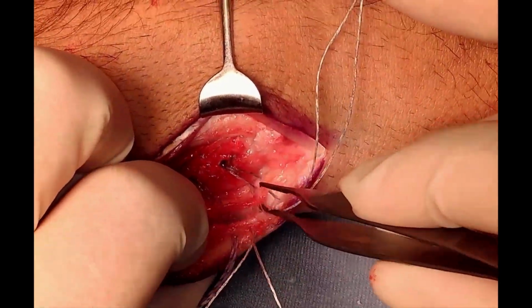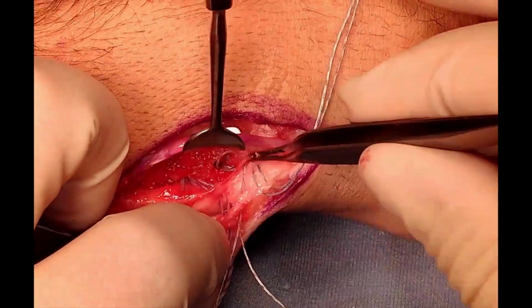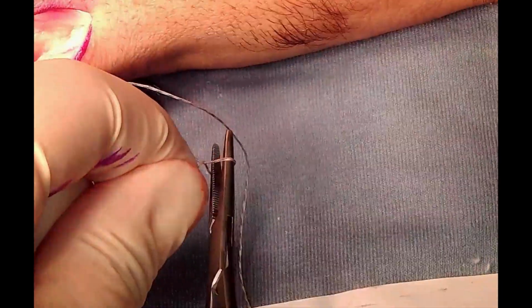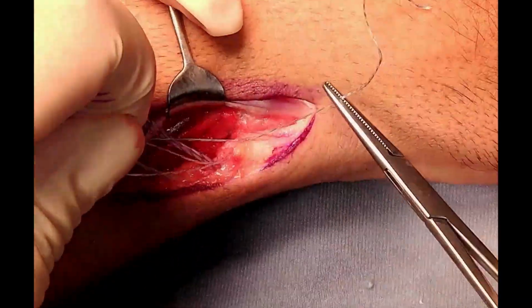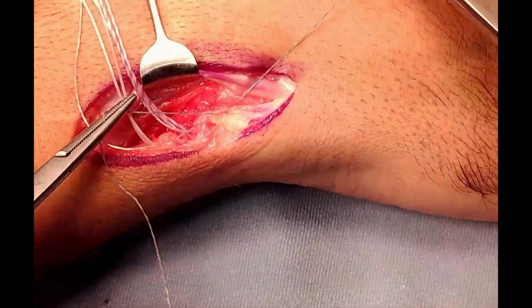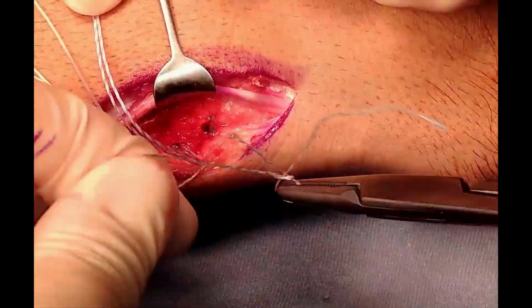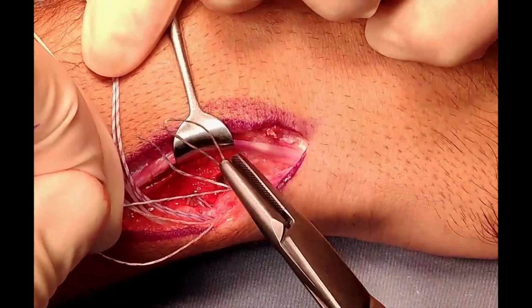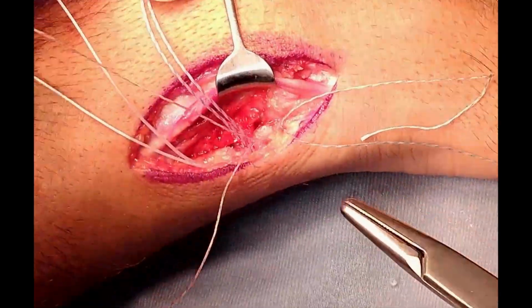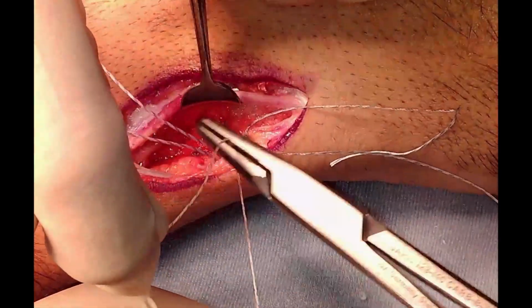bone, and we can see here that the holes in the ulna are dorsal and they are under the EDM, so we took it much radial and dorsal, and this will give us the stability that we need. I think we believe that this would be enough to help the patient's symptoms.